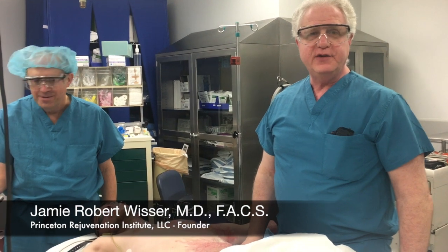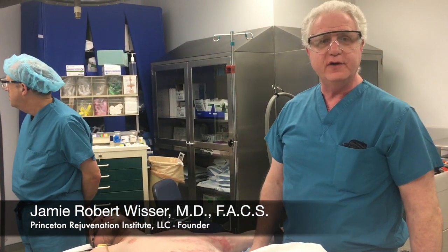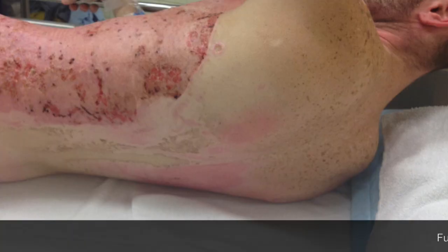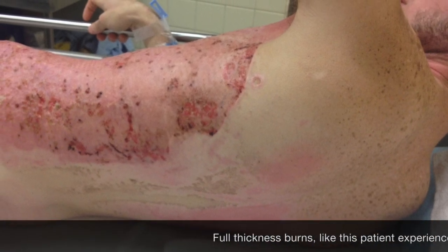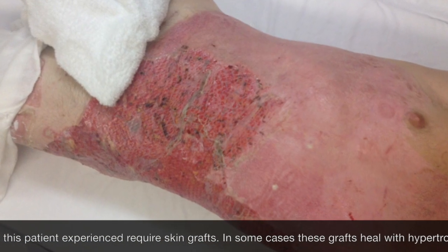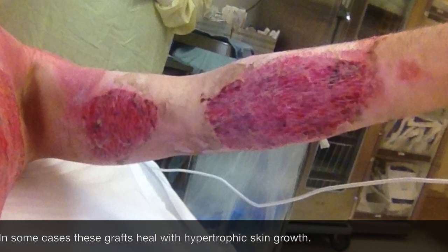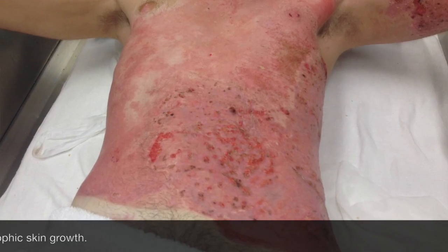Today we have a patient who is a burn victim. This gentleman has suffered extensive burn injuries to his trunk. Our intervention will involve utilizing a CO2 laser in the scar modality. The scar modality is a new advent that uses small diameter laser beams to break up the scar tissue and provide greater flexibility to the burned areas.